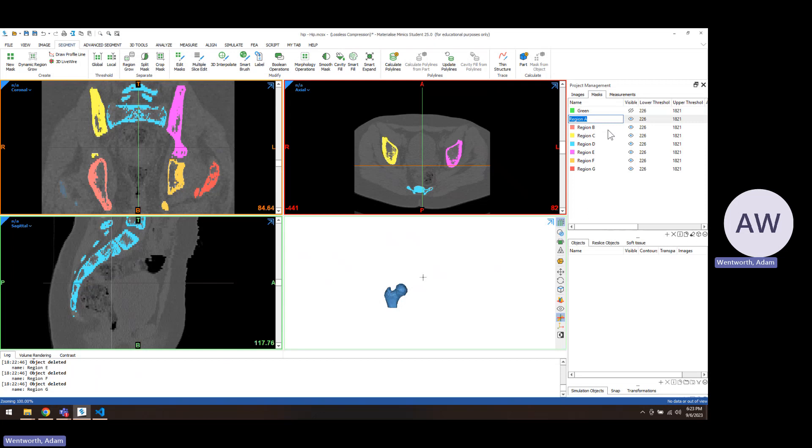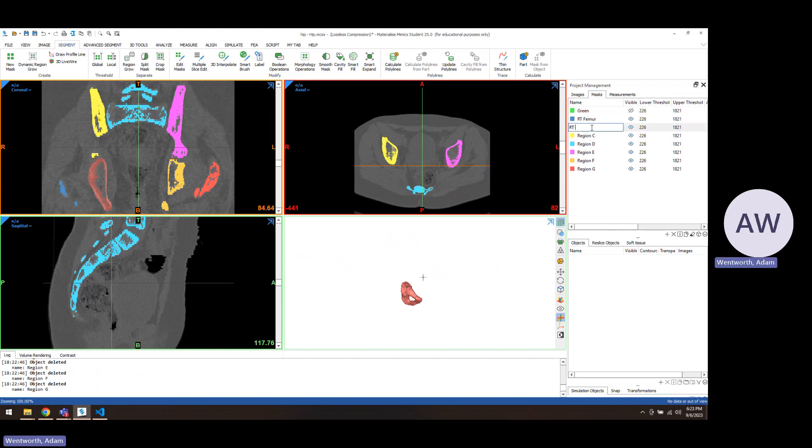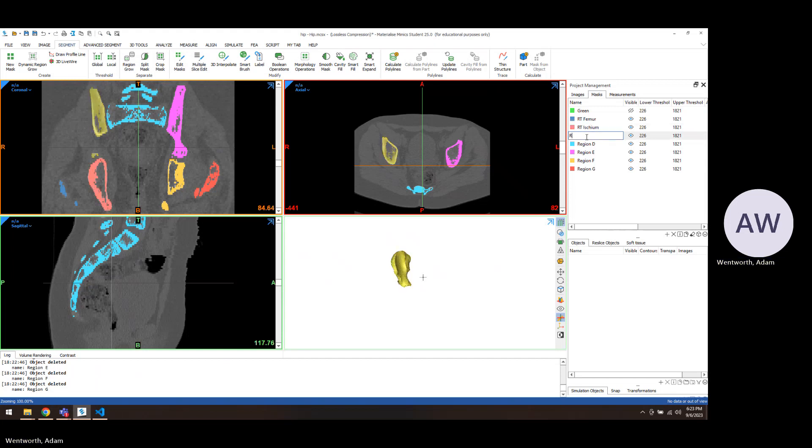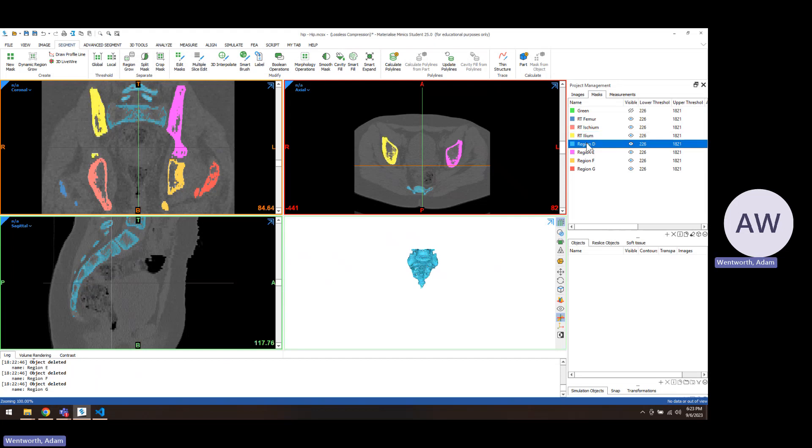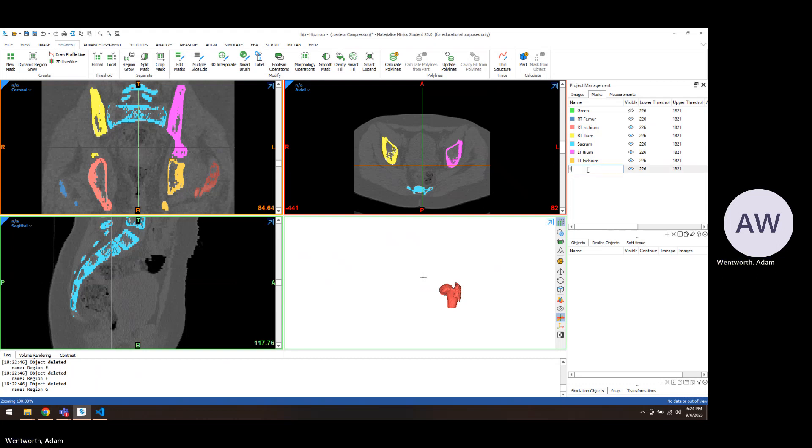And the reason we're doing that is because we eventually want to get these bones filled in solid and the operations to do that are typically the smart fill. If you have very thin spaces between bones and it's all one object, you go to fill that and it fills in the little gaps between all the bones, which there's no bone there. So we don't want that. Next, we'll start labeling things. So it's a little counterintuitive. We'll start with the right femur is actually on the left side of our screen, because we are looking at the patient, the front of the patient and it's the patient's right leg.